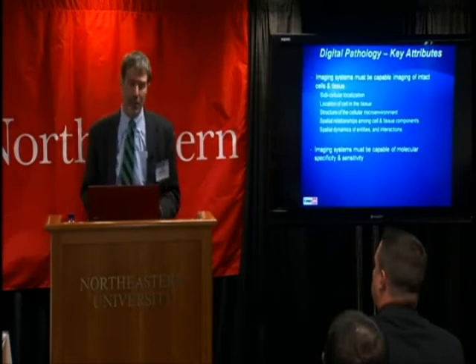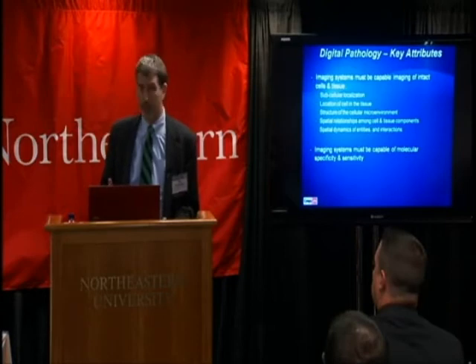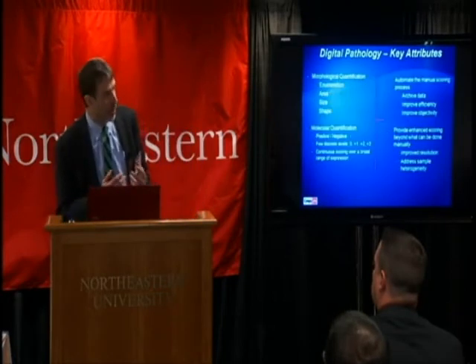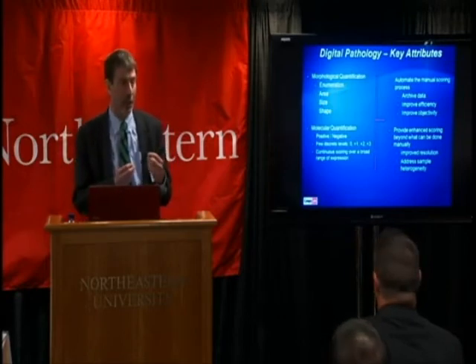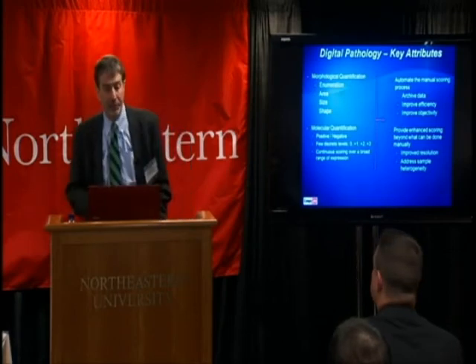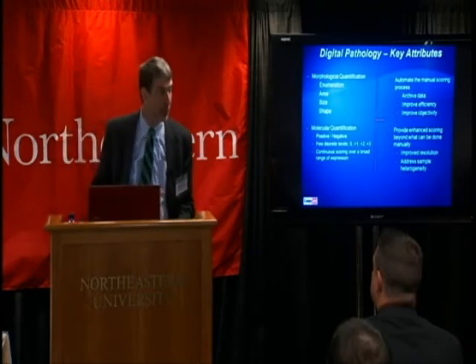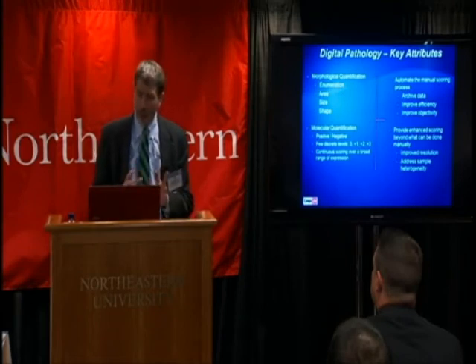And the second thing is imaging systems must be capable of molecular specificity and sensitivity. They must be capable of really quantifying the amount of, as Badri said, the molecular player involved. And that's something that flow cytometry has traditionally done very well, and that's an attribute that needs to be a part of imaging.